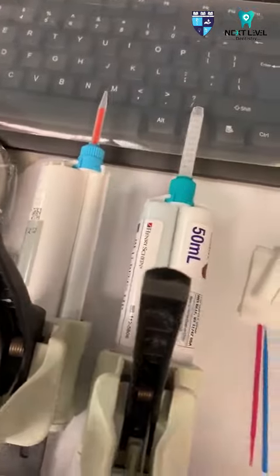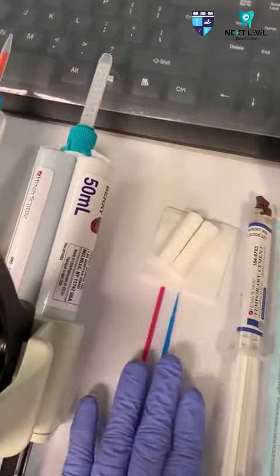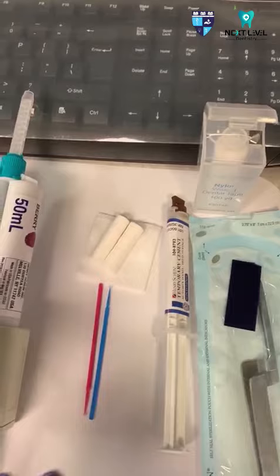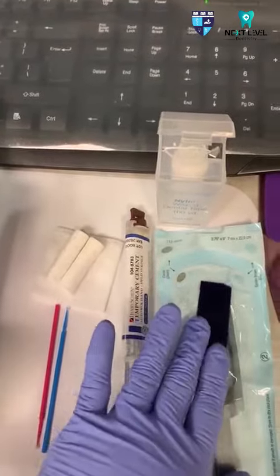Once everything is okay, we're going to be cementing it, clean the area with the micro brush tip and the floss. Before you dismiss the patient, don't forget to give postoperative instructions.